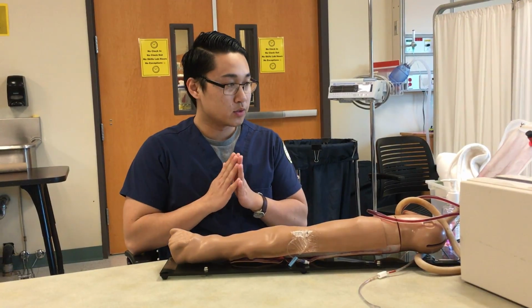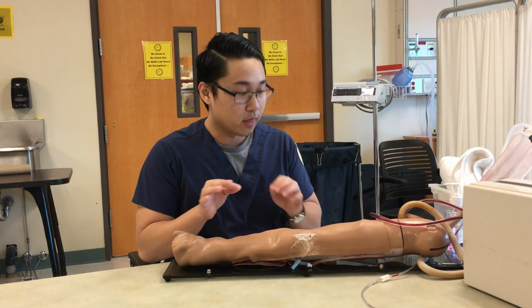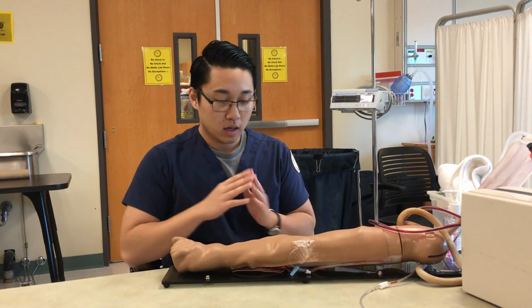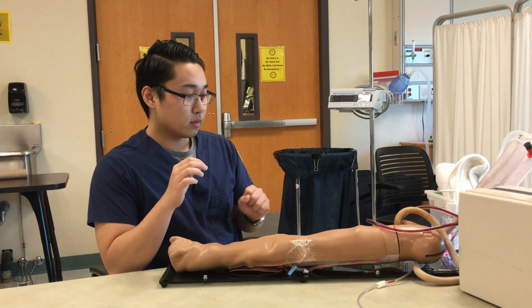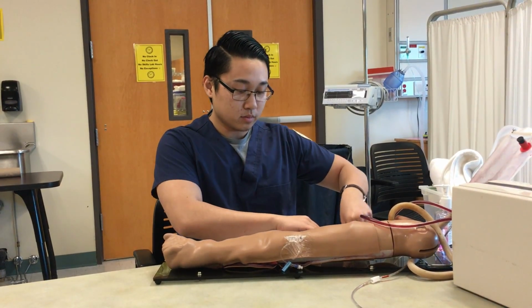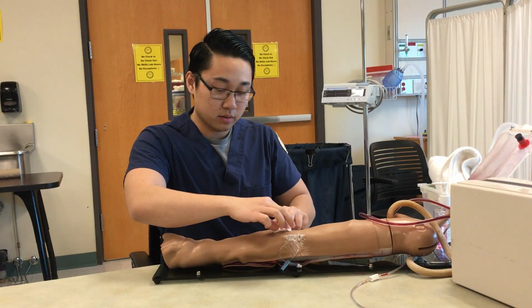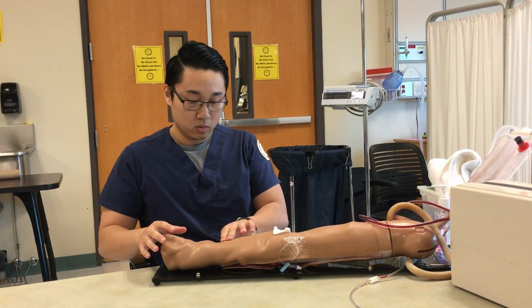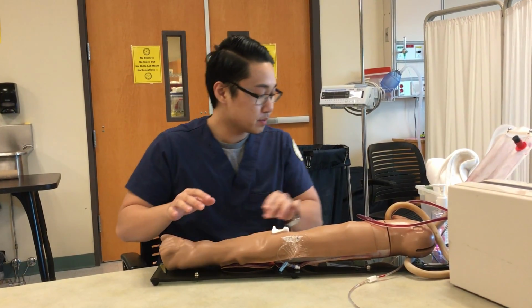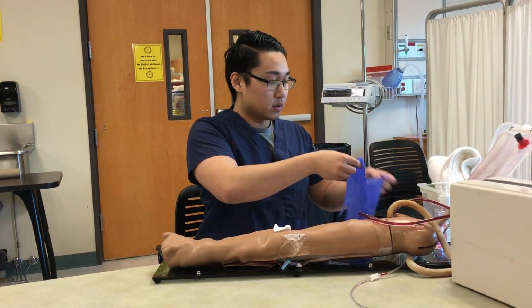So I'm also going to, before I do any poking, make sure that they have been on supplemental oxygen for at least 30 minutes. Now I will start my procedure. I'll ask if I can put the gauze on their arm just to be ready. I'll feel where their pulse is. Alright, I'm going to put some gloves on.